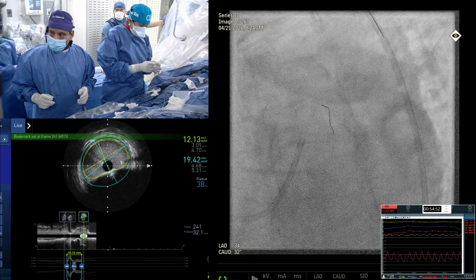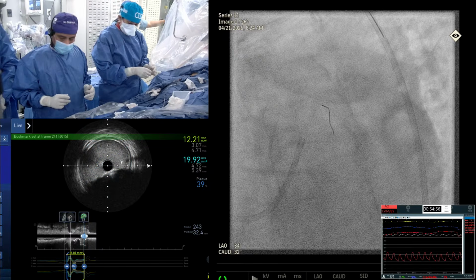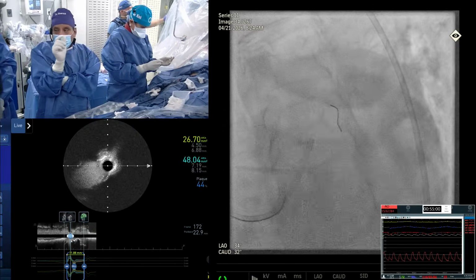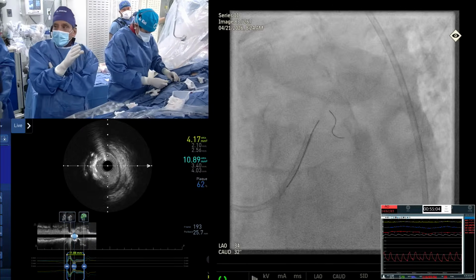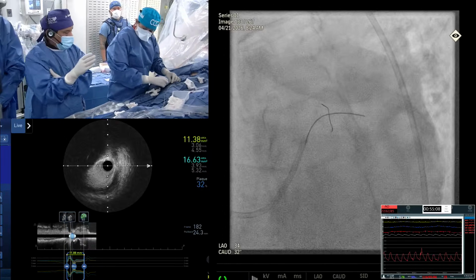So Samir, you were right, that maybe it was just the way the circ was taking off. Something told me it may not be. And then see that calcium, it is not a nodule, but there is a calcium only barely 70 degrees, not even 90 degrees. Yeah, no, nodule is there in the left main.